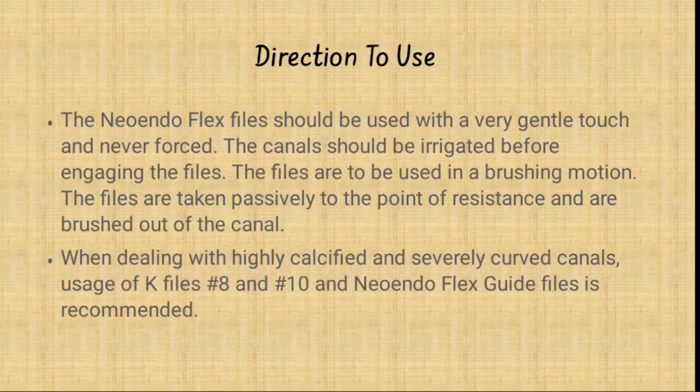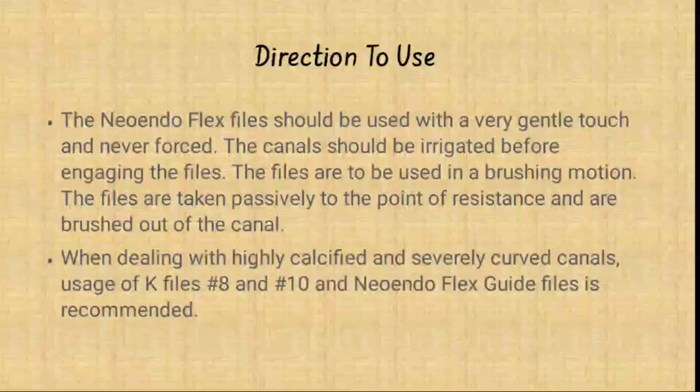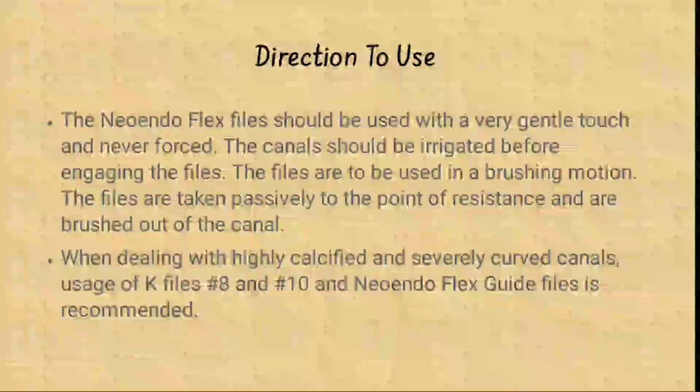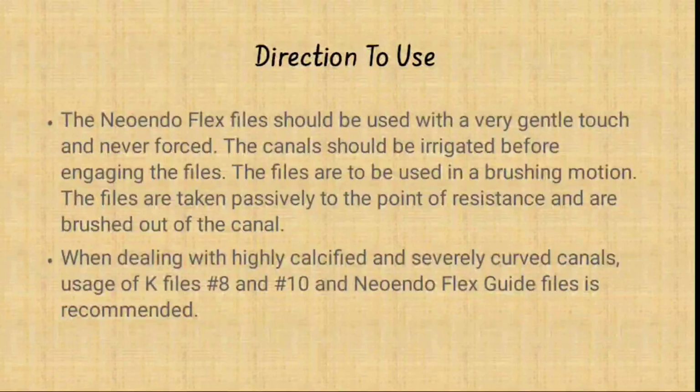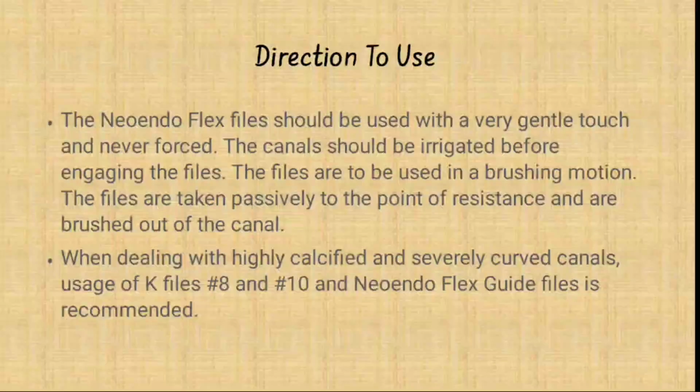Do not push it apically, do not force it, and keep irrigating. And it's better if you use EDTA gel, RC Prep, whatever the brand is, before using it inside the canal, because canals are dry and it really helps in minimizing the chances of breakage.